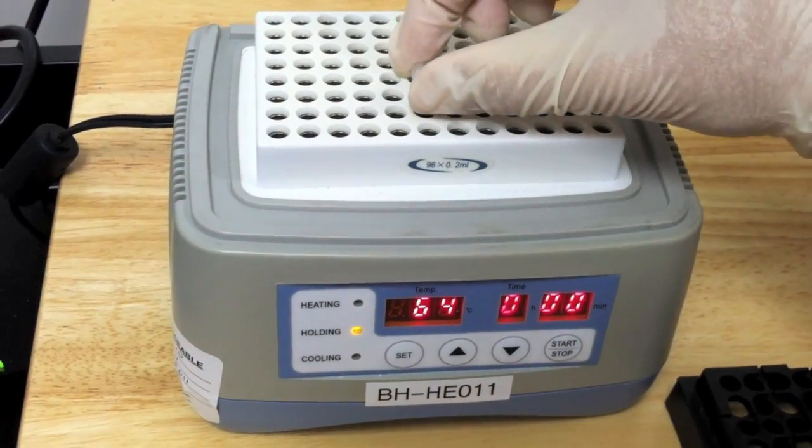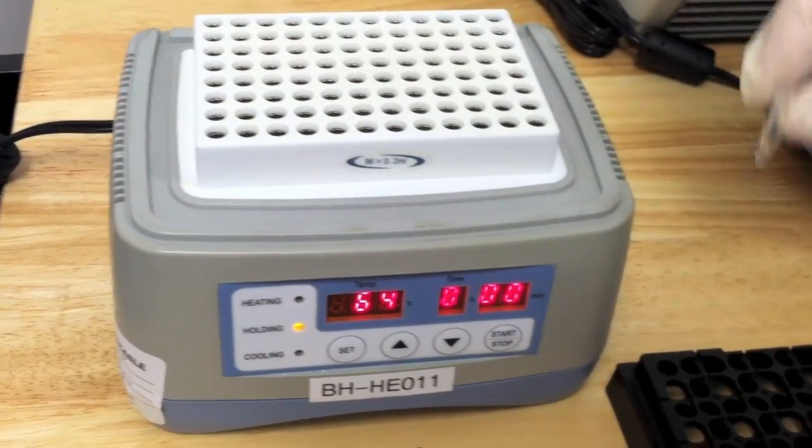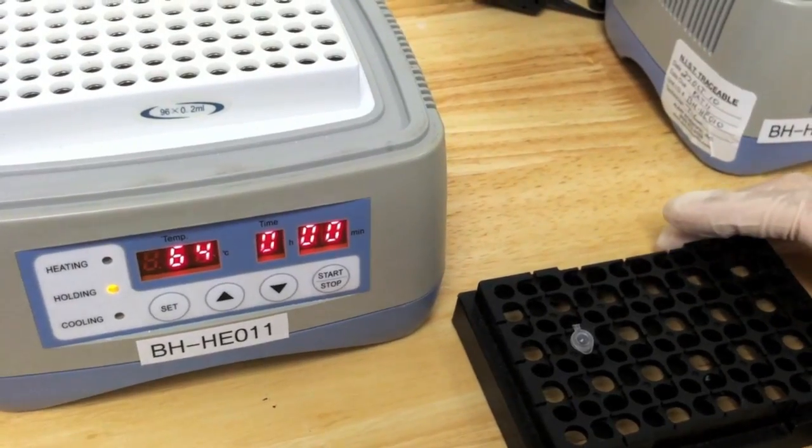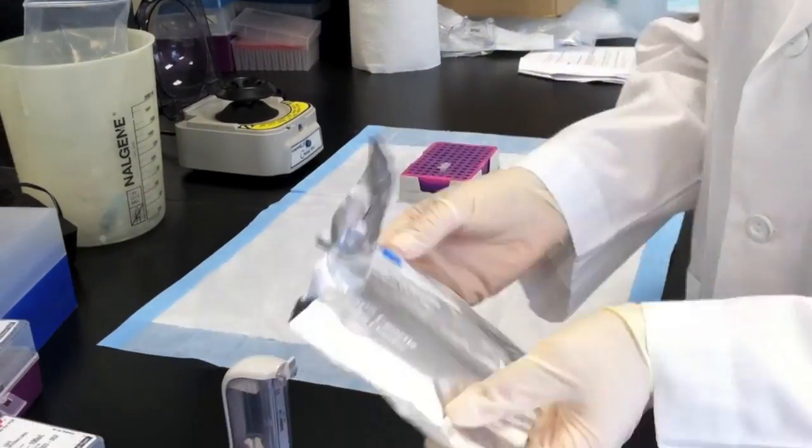Remove the reaction tube from 64 degrees Celsius after 60 minutes. Place the tube in a rack at room temperature. Tear open a new cassette package.